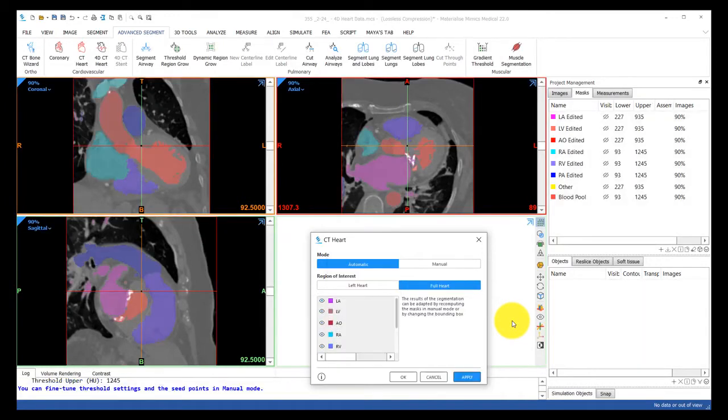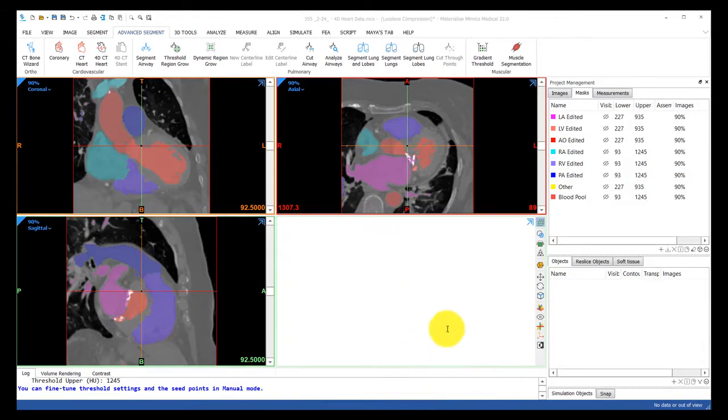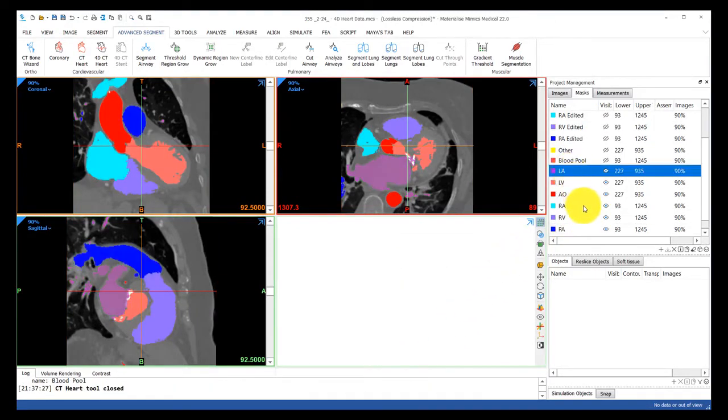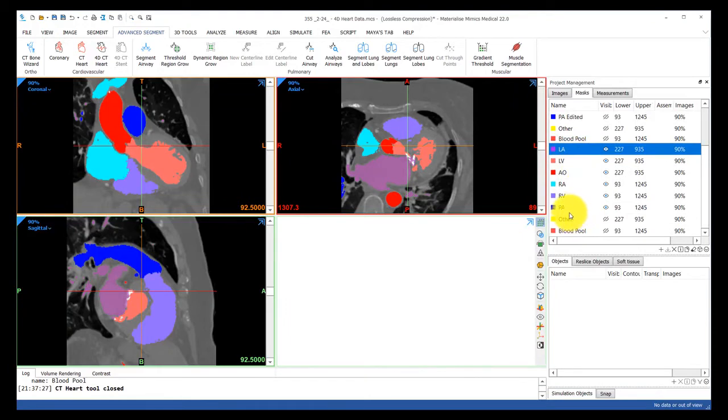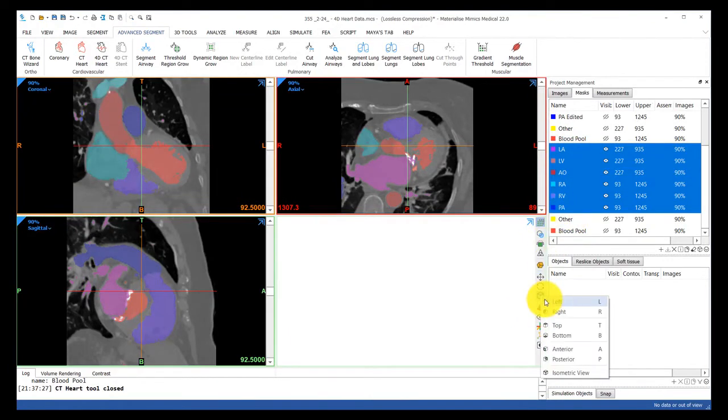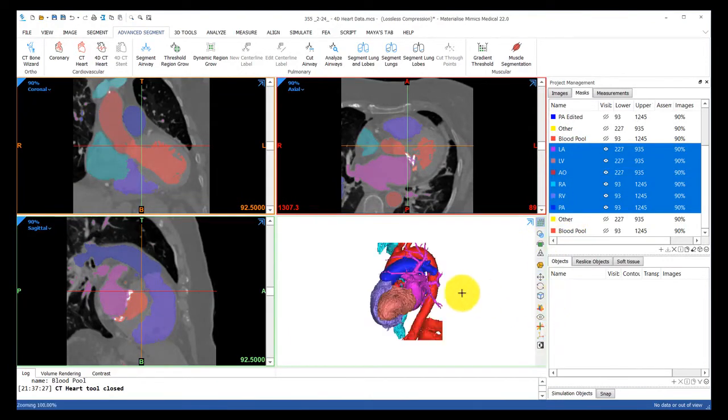As a result, you can see we'll have all the chambers of the heart segmented and labeled automatically for us. I'll select them all under the masks tab and show you what's been created.